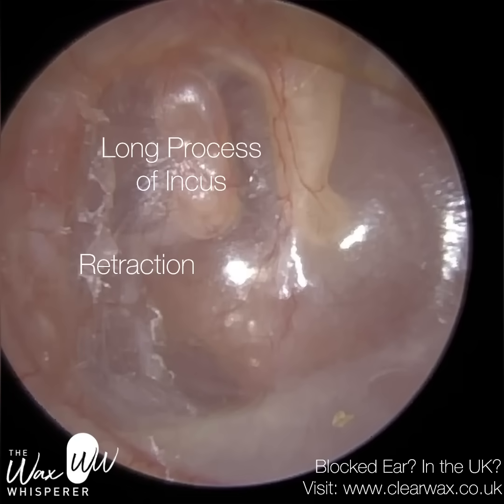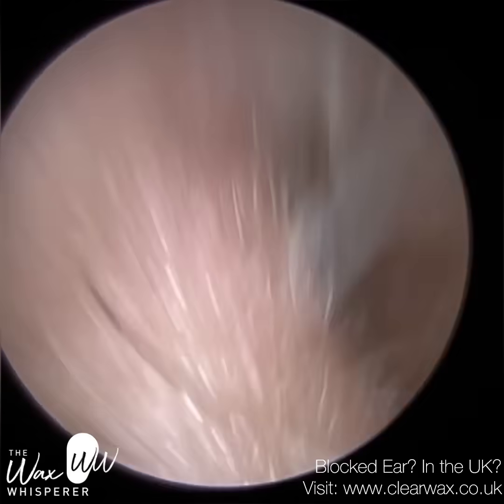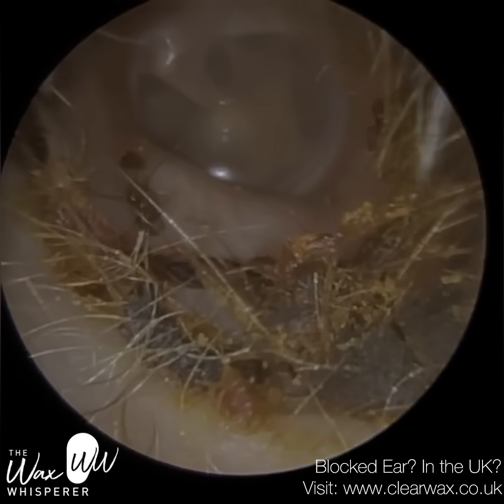And you've just seen there, we just peel some skin off the back part of the eardrum, and you can see the retraction, and that's the long process of the incus. The long process of the incus looks slightly deformed. So when the eardrum is sucked in, and I'm going to come back to that. So the eustachian tube, we've discussed the functionality of that.